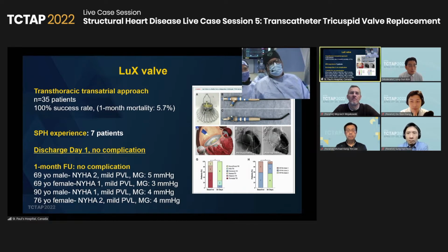Sure. I think Dr. Aquadat said something about TriClip. I think TriClip tends to be our default, but this patient really has very poor imaging of the septal leaflet. We saw in the opening images that the transgastric views are quite nice, and being perpendicular to the coaptation plane would not be an issue, but then grasping the septal leaflet would be a big problem because of shadowing from the mechanical valve. So we didn't think it was a good option for this patient.